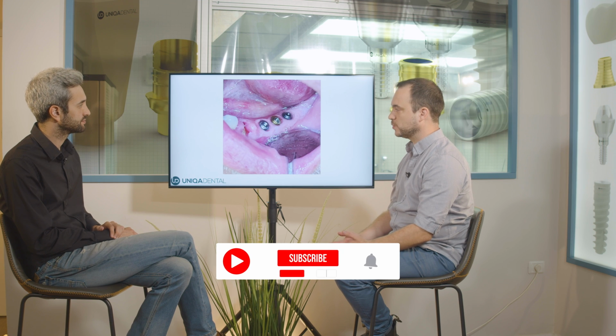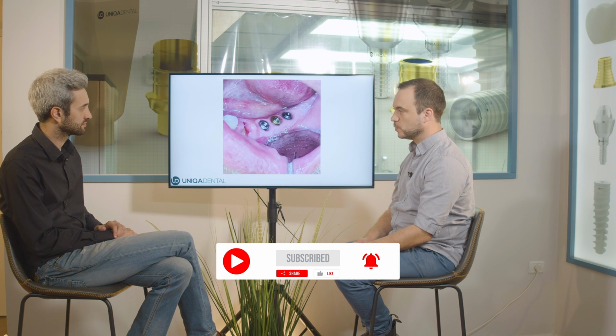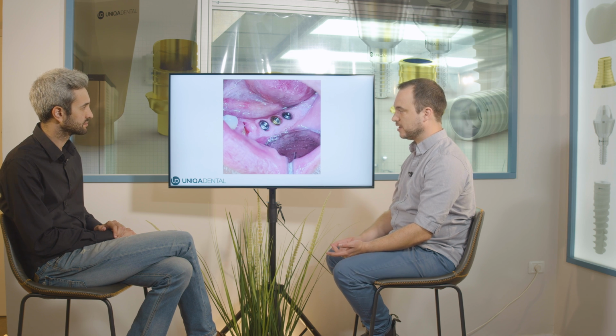We can just add another cantilever, and this way, without adding any implants, without making any unnecessary surgical procedures in this case, we can make a new bridge that will fit and hold, and because you have the support of 3 implants, it's enough for this one cantilever. So what we did here is, first of all, we extracted the tooth. We took out the crowns on those 3 implants, and we need to make an impression. We made an impression on those 3 multi-units, and right now we want to make a provisional bridge on those 3 multi-units and see how it fits, see the functionality, check out how the bridge is in the mouth.